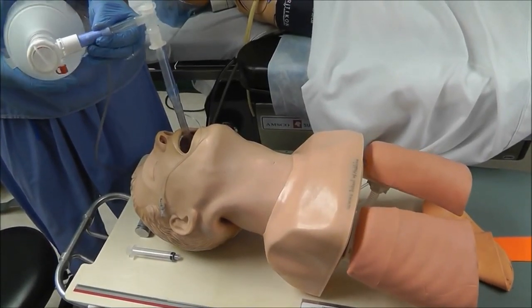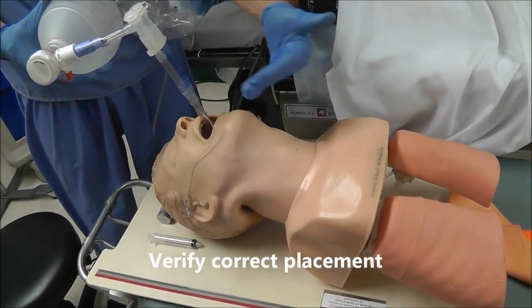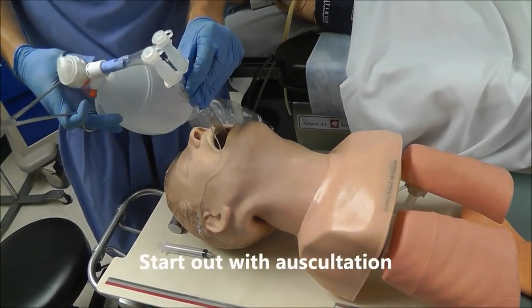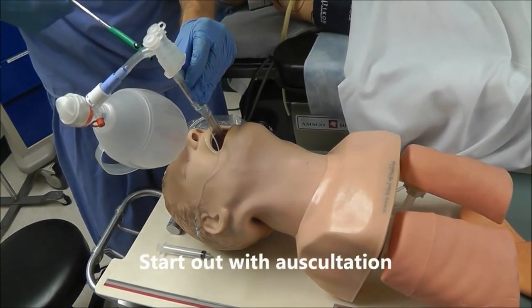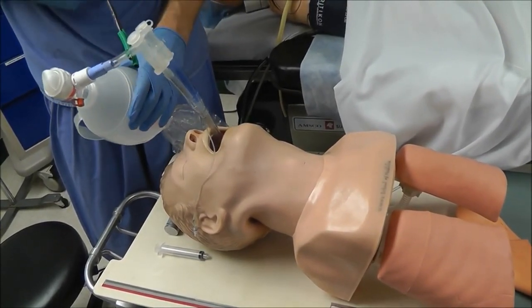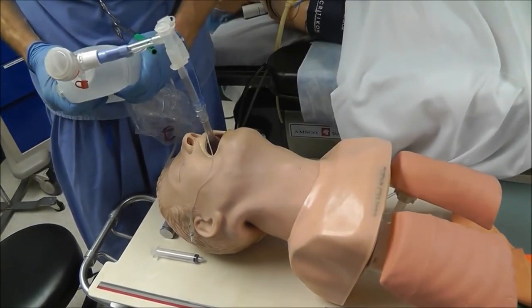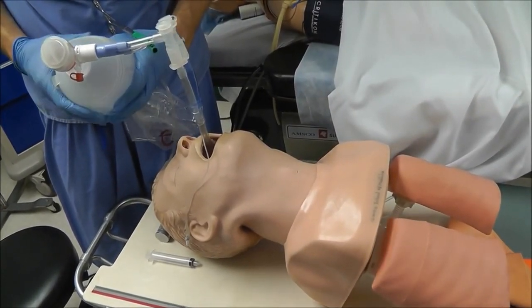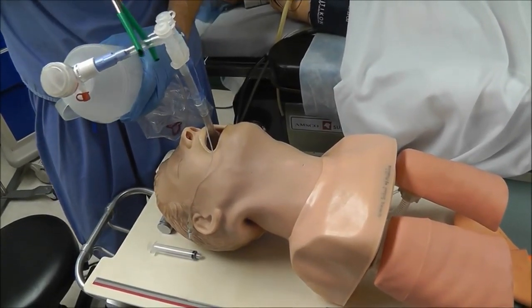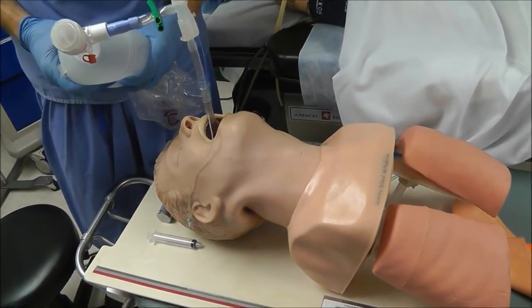Once you can verify that you can ventilate the patient, we need to check whether this is correctly placed. The first method is auscultation, and to do that you need to clamp one of the lumens. Here I'm going to clamp the bronchial lumen. If this is correctly placed, I should only hear breath sounds on the right side, and you can see that's true. Then if I clamp the tracheal lumen, I should only hear breath sounds on the left side, and that's the case.